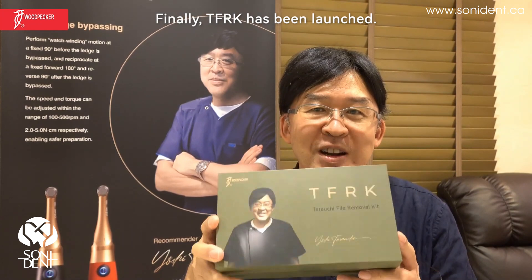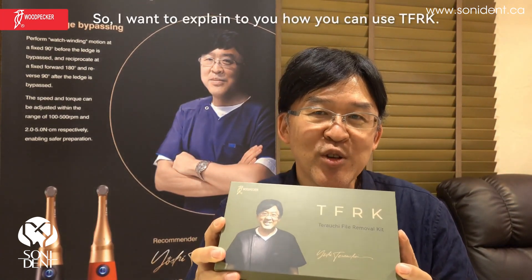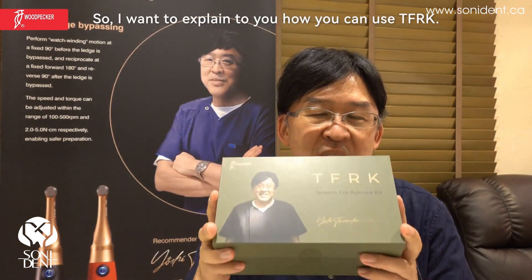Hello, my name is Yoshi Terawuchi. Finally, TFRK has been launched. I want to explain to you how you can use TFRK.